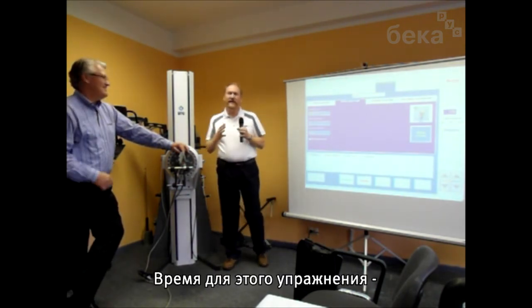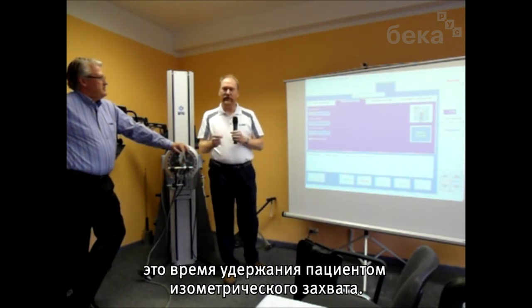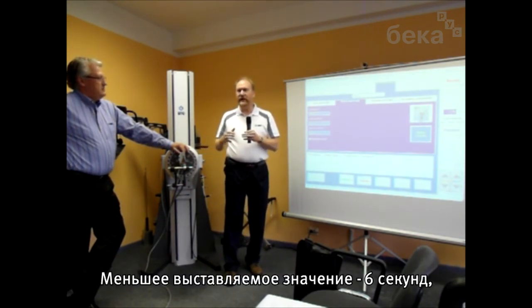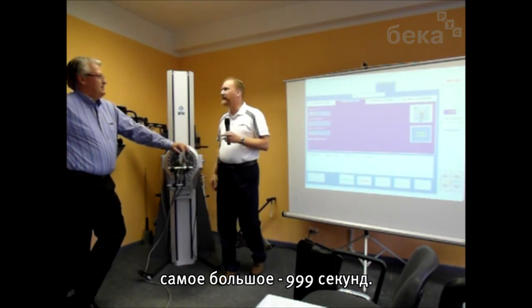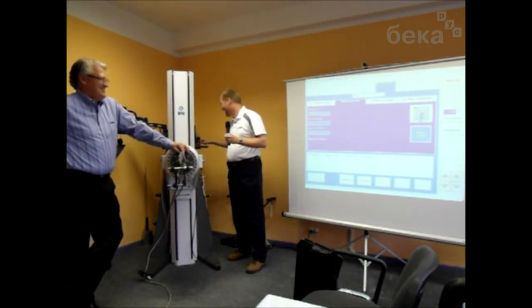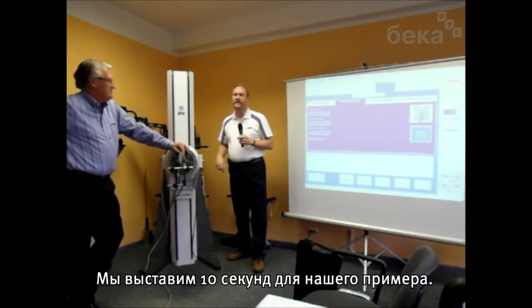So the time for this exercise is how long you want that person to hold and sustain that isometric contraction. You can set that as low as 6 seconds and as high as, I think it's 999 seconds. Wow. Please don't. So we'll do a 10-second trial for this example.